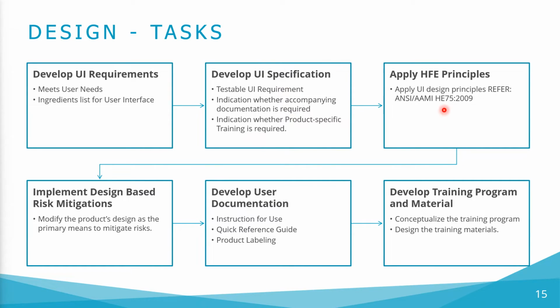Apply HFE principles to product design. In the course of developing the product, we should apply UI design principles described in numerous textbooks and guidance documents, such as ANSI AAMI HE75 2009. We can also rely on our own and our team's knowledge of design best practices.